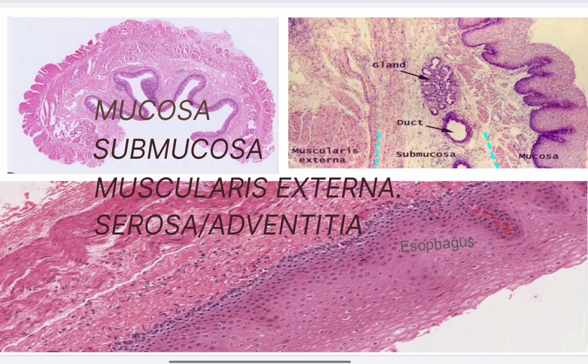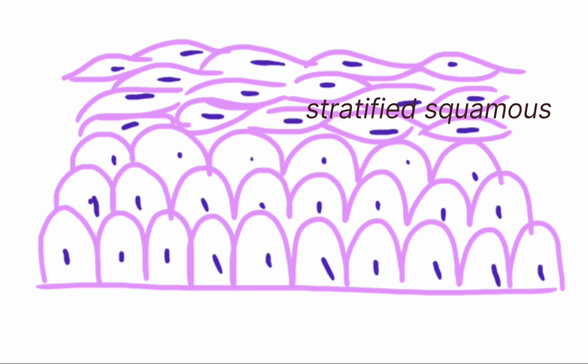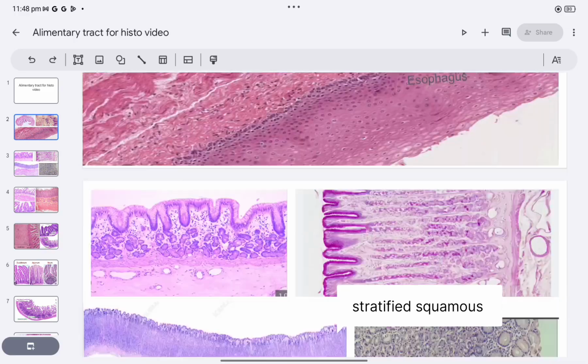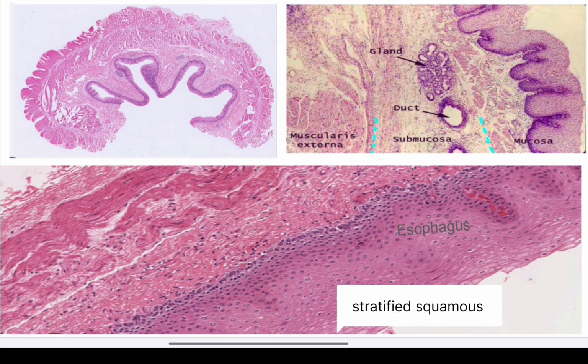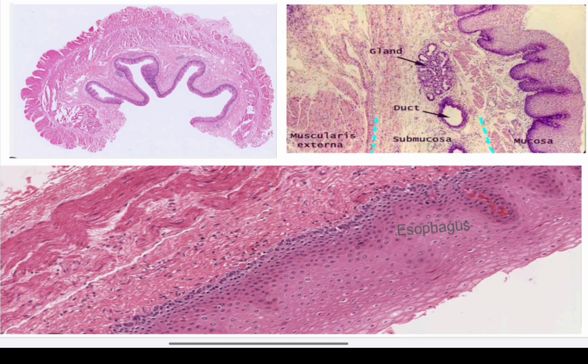In the first slide, we can see the epithelium is stratified squamous epithelium, because it is multiple layered, and there is a deep purple colored border at the bottom of the epithelium. It can be seen irrespective of how low the magnification is. So whenever you see an epithelium with a deep purple border at the bottom, you can go with stratified squamous epithelium.